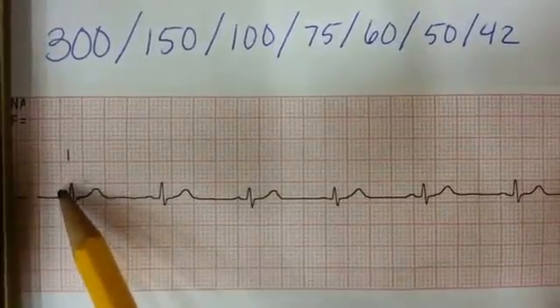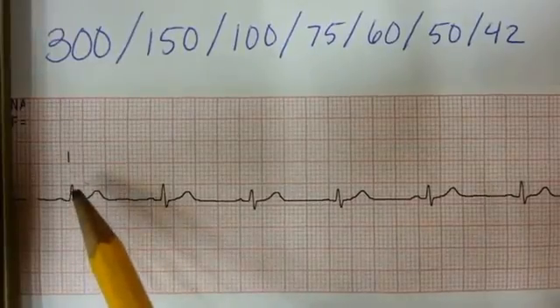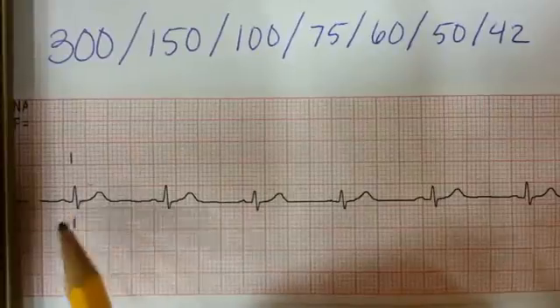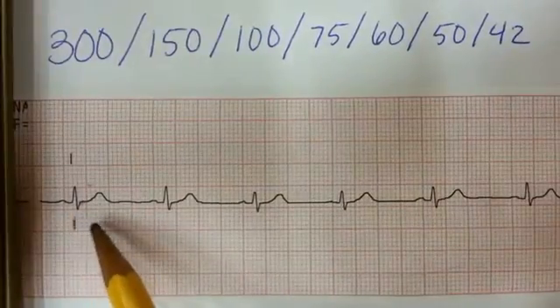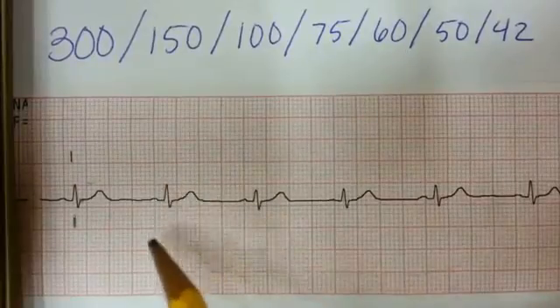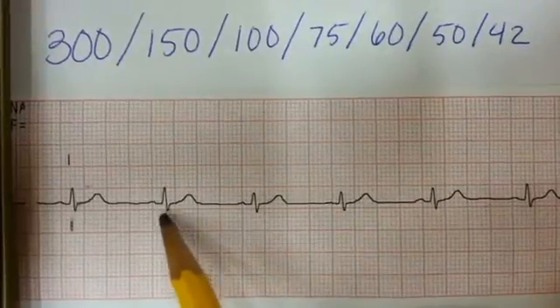We can notice that it's one, two — about two and a half small boxes in. So we're going to make a mark. Now we're going to go and take a look at where our next QRS complex falls. Our next QRS complex is going to fall about that two and a half mark as well, and I'll take a mark.